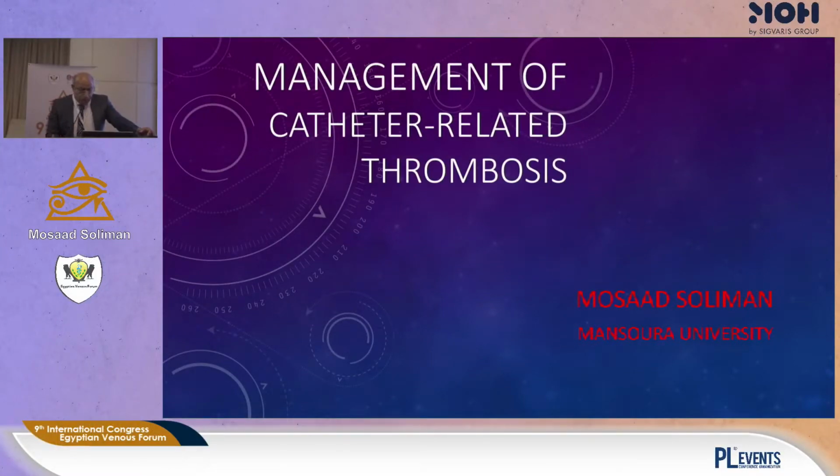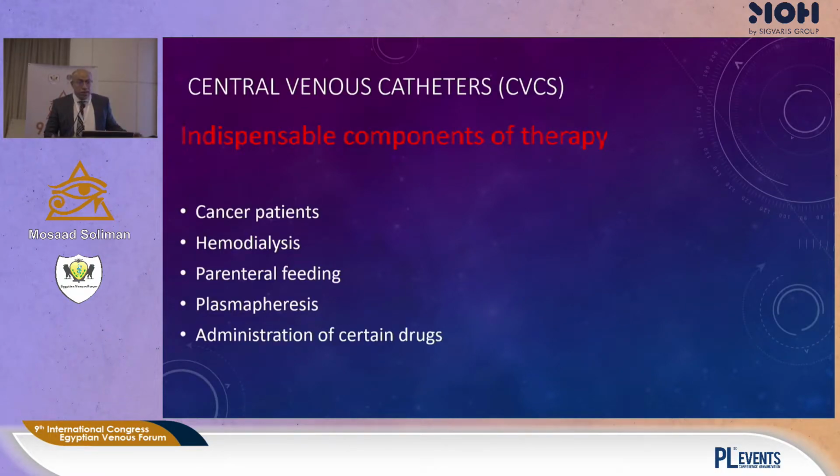So, how are we managing catheter-related thrombosis? Actually, you have to know what catheter-related thrombosis is. What do we need the central venous catheters for?